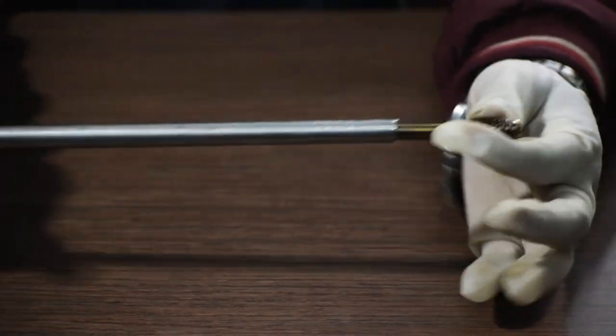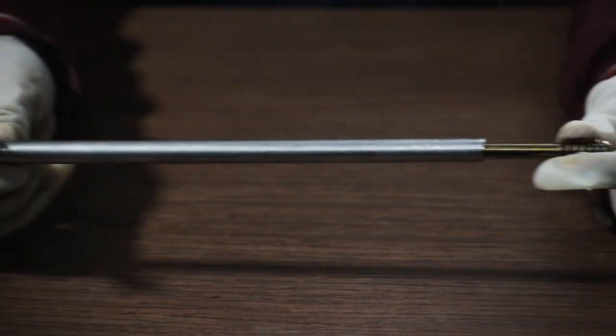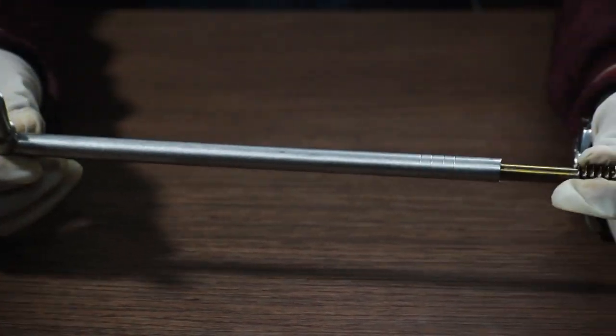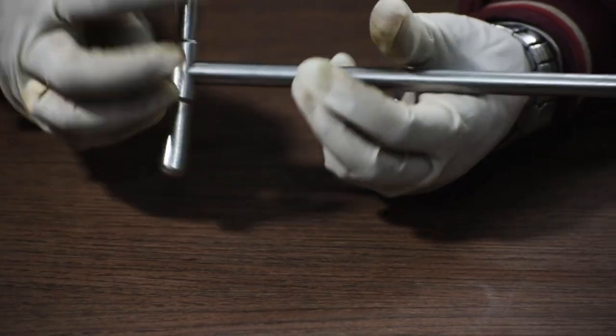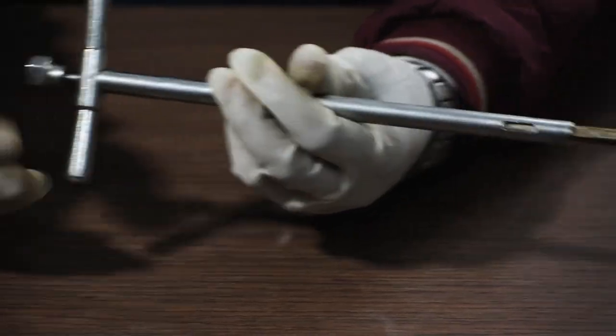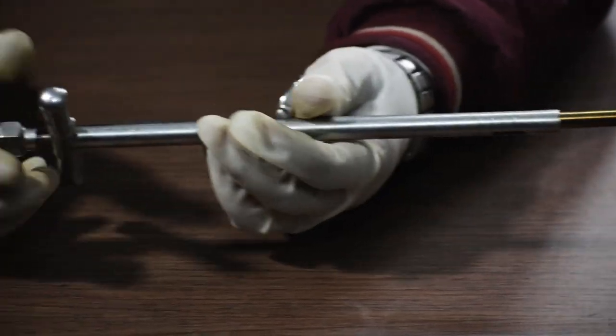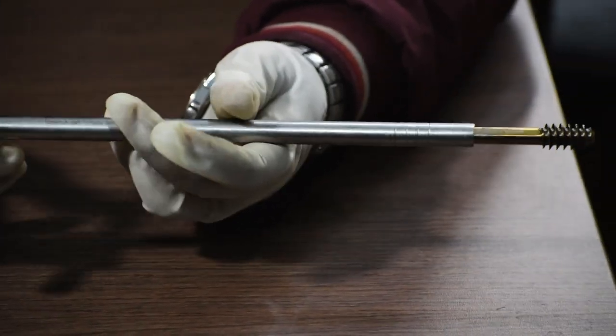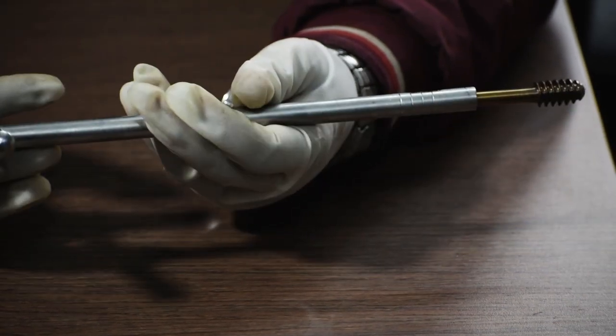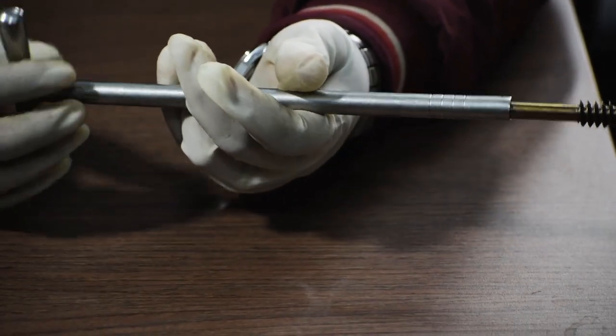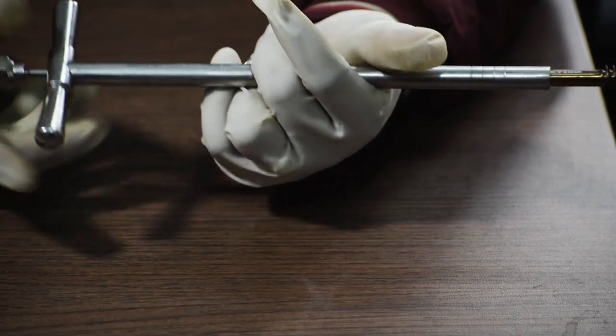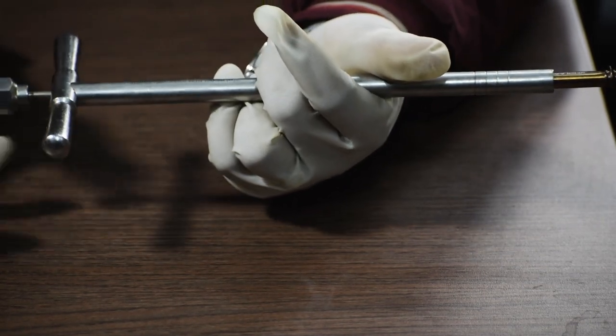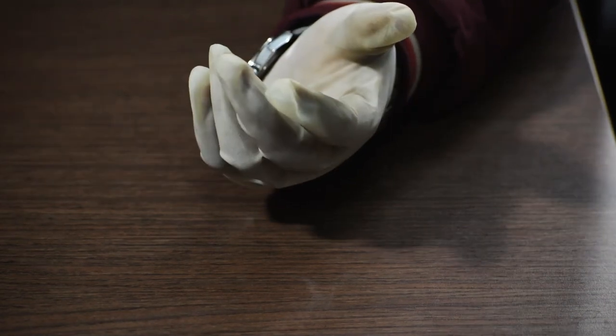This basically constricts the movement of the lag screw. Now, after that we start rotating anti-clockwise to take out the lag screw. Once the screw is removed, then further measures are taken to remove the DHS screw which we will cover in a later video.